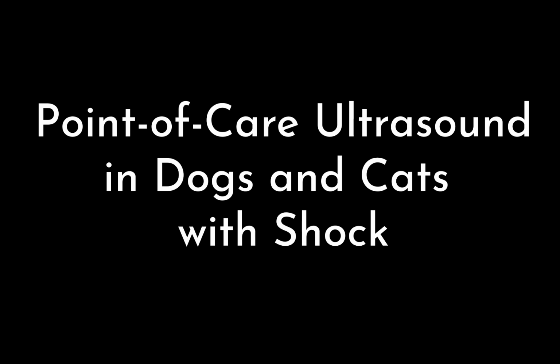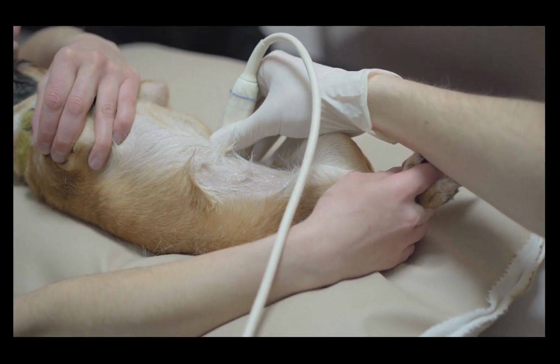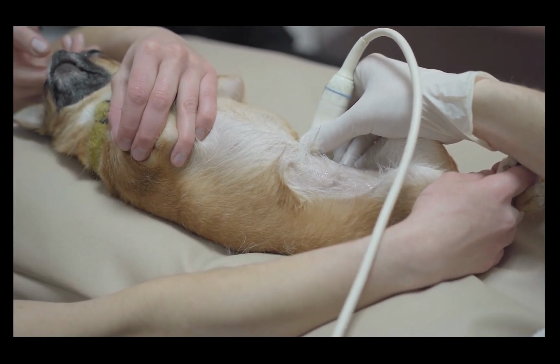In this video, I will talk about the use of point-of-care ultrasound in diagnosis and monitoring of undifferentiated shock patients. Point-of-care ultrasound, or POCUS for short, is an invaluable diagnostic tool that I have been using for a very long time during my career in emergency and critical care medicine.